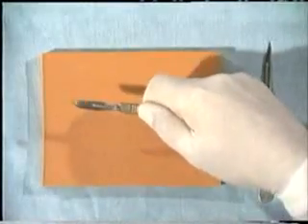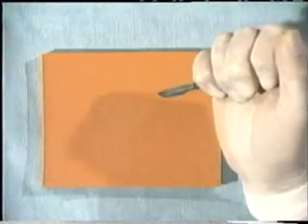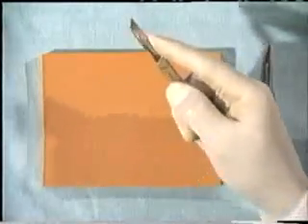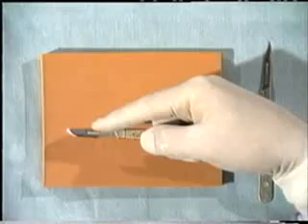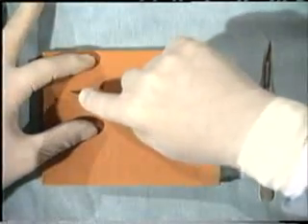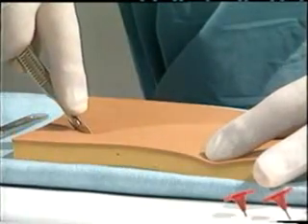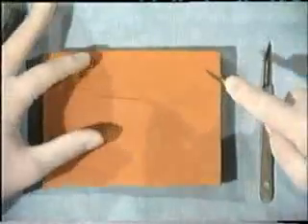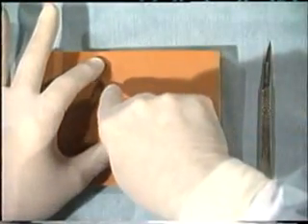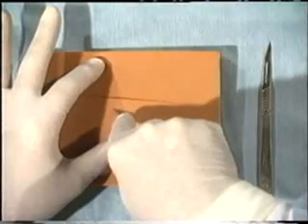When handling the scalpel, you do not handle it like this or like this, as you don't intend to stab anyone. Instead, handle it in this manner, using your index finger to steady it. Then you can draw it gently and carefully across the skin, as you see here, in a controlled manner. Never ever cut towards your own fingers or thumb, as it may not just be the patient that you cut.